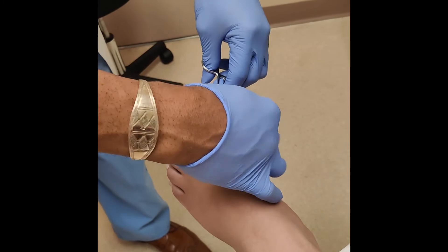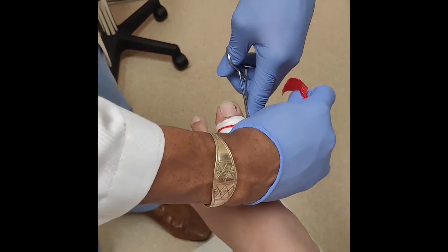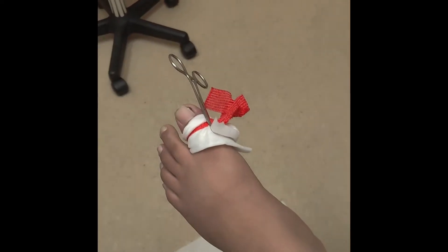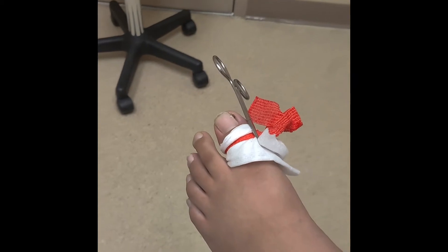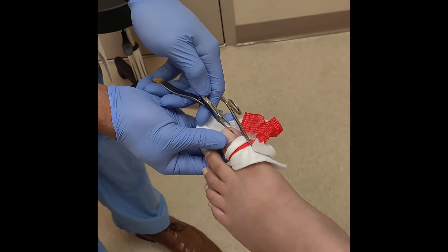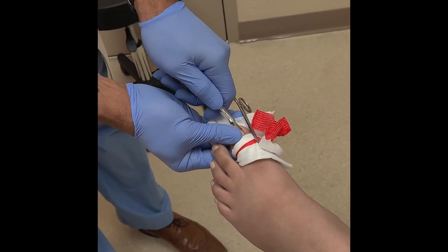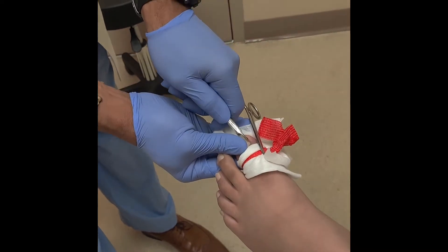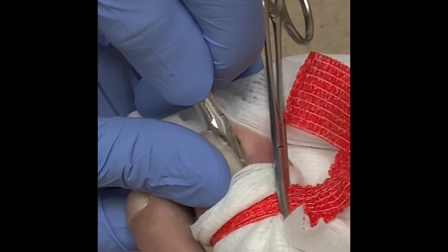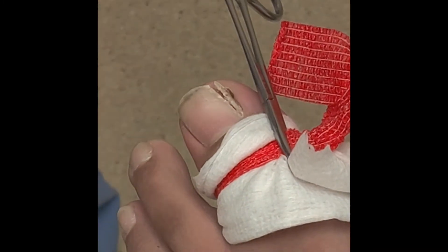Let's get it on this side. There we go. Okay, very good. We are almost there. All right, how does this feel? You can't feel it. Okay. Can I feel it? Good. So we're just kind of releasing that there.